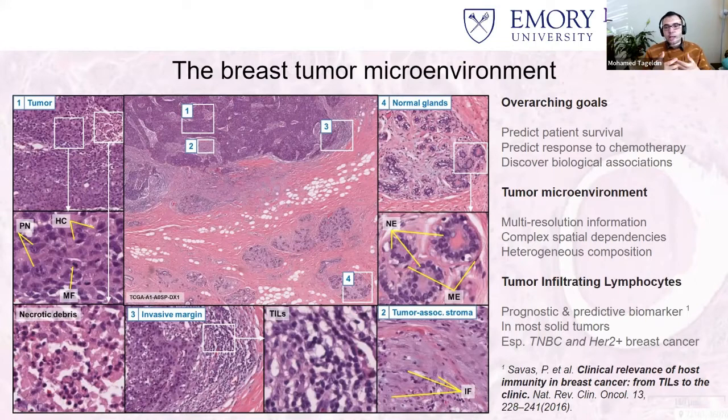Well, any computational algorithm that aims to do computational grading, or that aims to predict survival, discover associations, in order for it to be understood by someone, eventually you will have to get to the bottleneck of linking this to structures that people already know what they are, right? So heat maps can help a little bit with that, but really ideally you want to understand the individual distinct structures, as I will allude to in a minute.